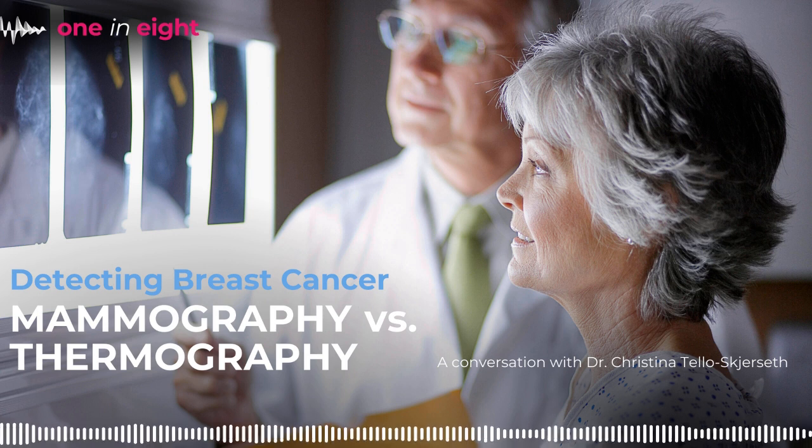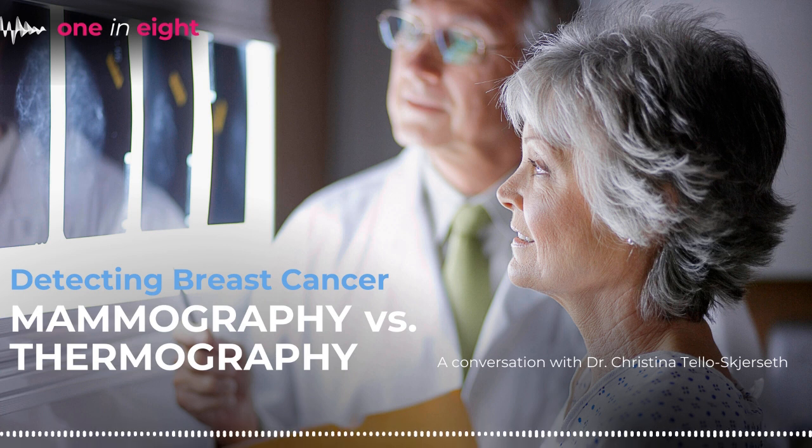Some of the harms of mammography, and I say harms in quotes, the main one is radiation. So yes, we're taking x-rays of the breast, and that makes radiation.